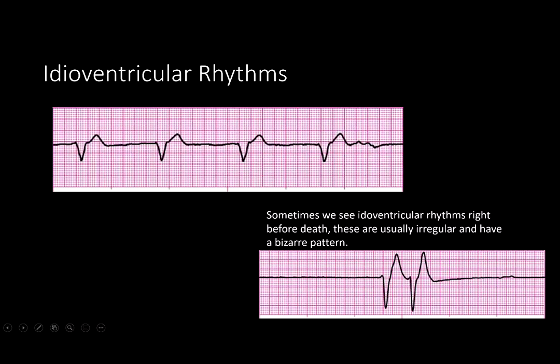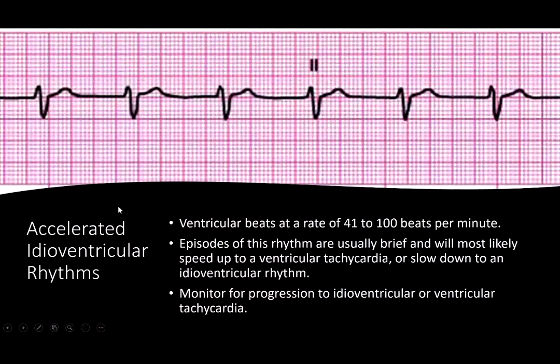And again, you can just kind of note that very wide, bizarre QRS complex. So you don't even have to measure this to tell how wide the complex is.